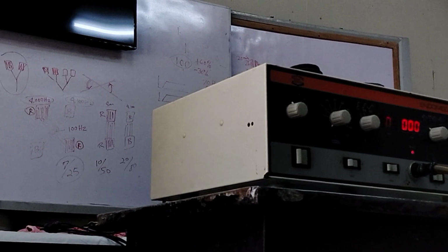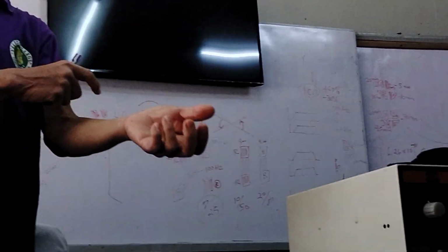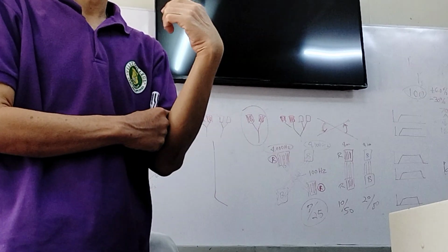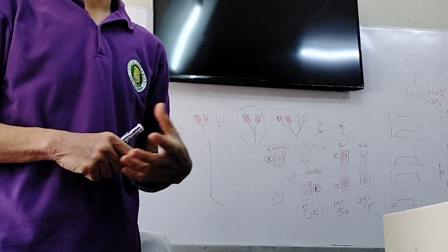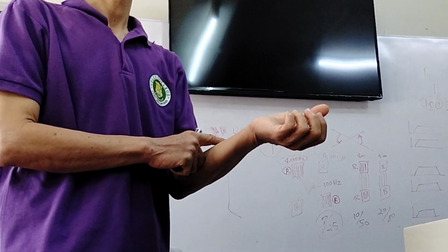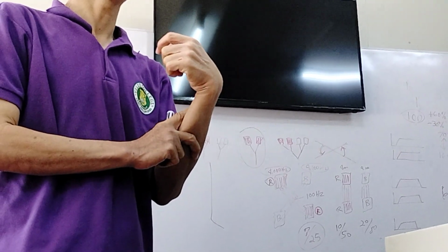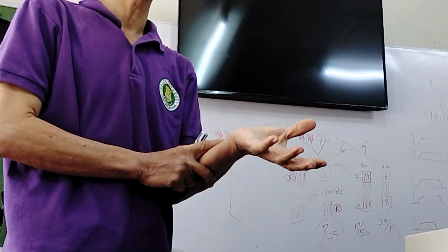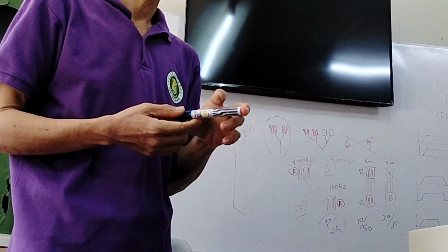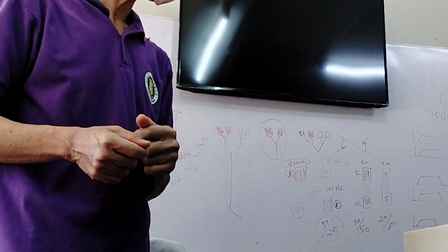Okay, if let's say 7/25 for synchronous, you're stimulating two muscles, so the two muscles will contract at the same time for 7 seconds. If asynchronous, what will happen is that one muscle will contract first for 7 seconds, and the other muscle will then contract for another 7 seconds. After that, the two muscles rest for 25 seconds, or the wave of contraction rests for 25 seconds. Okay?